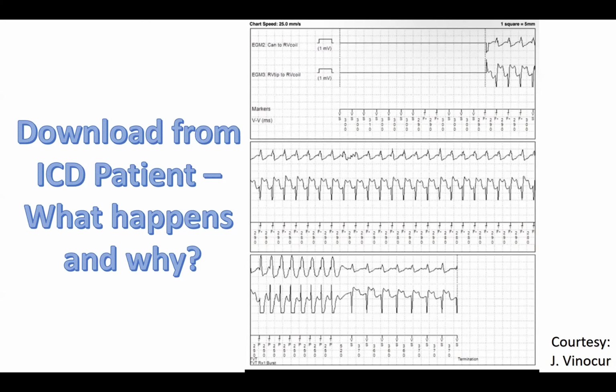That was actually frightening to us, because it meant that basically we converted VT at like 210 into VT at 190. And the concern was that the patient could have serious hemodynamic embarrassment from that without a therapy from the device. So one has to be careful with this, but there are many patients in whom pacing is helpful. Most defibrillators, while they are charging, which typically takes anywhere between 5 and 10 seconds, sometimes even as long as 15 seconds, will attempt to pace terminate an arrhythmia, and that's what happened here.